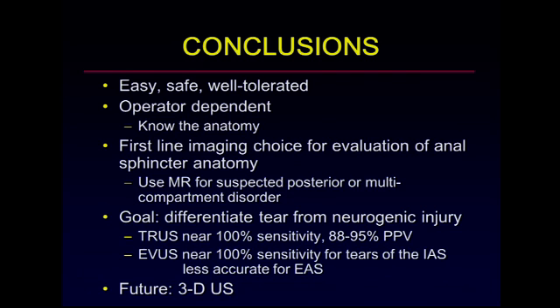And as always, one of the exciting parts about ultrasound are some of the new technologies and advances, and in the future I think three-dimensional ultrasound of the pelvis and of the anal sphincter will provide us even more information to help our surgical colleagues.